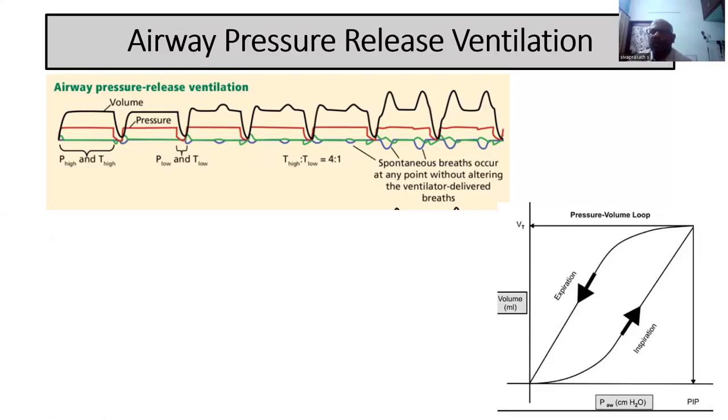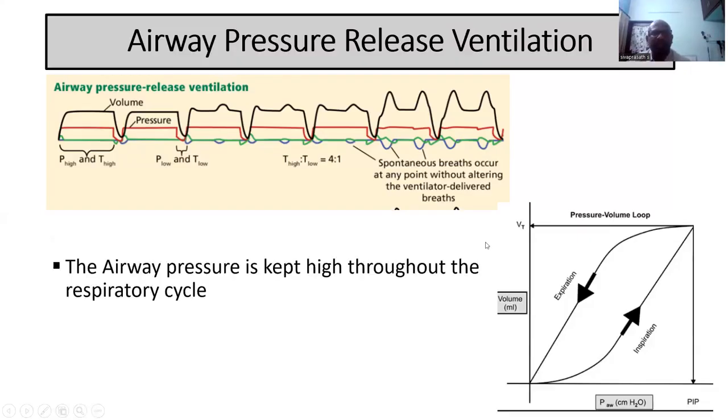And once the upper inflection point, that is the point of over distension, is reached, any amount of volume will only increase the pressure. So in a patient with ARDS, if the patient is fully paralyzed, I will only use tidal volume, lung protection ventilation with volume control ventilation. Here, when the patient becomes spontaneous, you can use this to keep the alveoli recruited. So I'll choose this APRV.